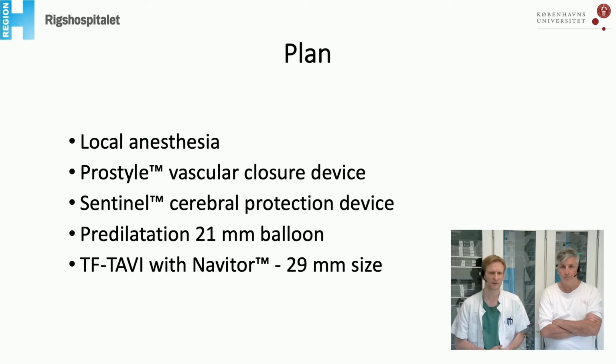So the plan for this case is a TAVI case in local anesthesia only. Prostyle vascular closure device, Sentinel cerebral embolic protection device, as said, pre-dilatation matched to the minimum diameter of the annulus with a 21 millimeter balloon, and then the new Navitor valve with this active Naviseal cuff on the outside, and a 29 millimeter size.